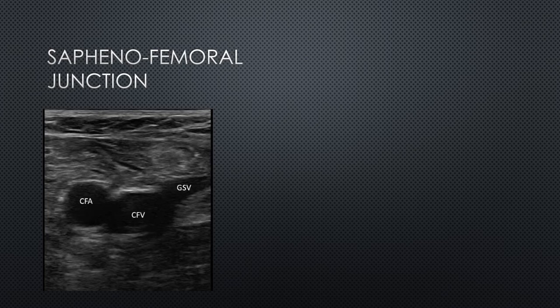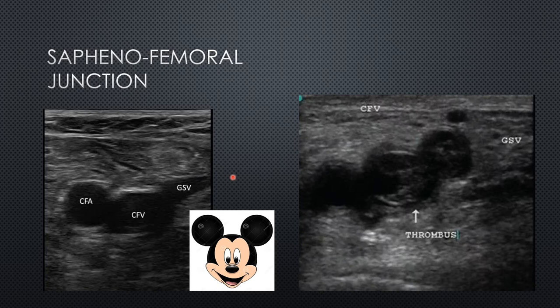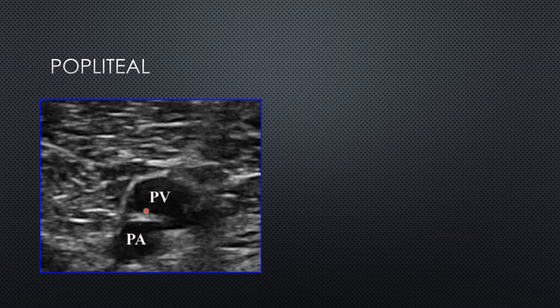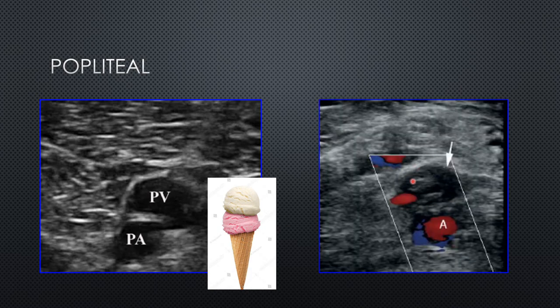The first compression point in the two-point technique is the saphenofemoral junction. Here's the common femoral vein in the middle, with the common femoral artery laterally and the great saphenous vein medially — sometimes referred to as the Mickey Mouse sign, with the vein as the head and the other two structures as his ears. Here's an example of clot: thrombus in Mickey's face and also in his left ear. The second compression point is the popliteal trifurcation, scanning from behind the knee. The most superficial structure is the popliteal vein, with the popliteal artery deep to that — sometimes called two scoops of ice cream. Here's an example of a clot: within that vanilla scoop, we can see a bright echogenic thrombus.